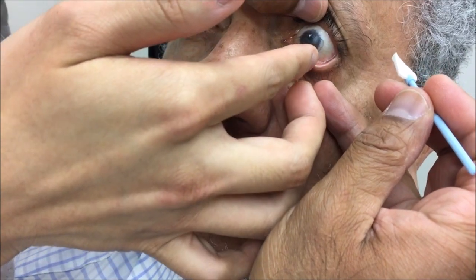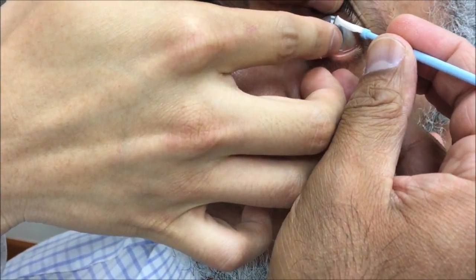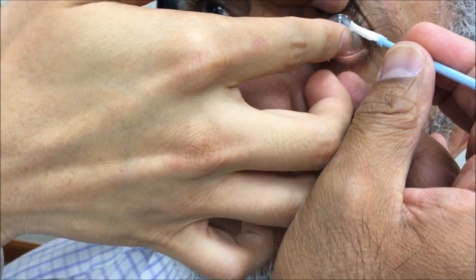Soft contact lens going on. Good — I'm just going to help. Go ahead a little closer, Wex, go ahead.